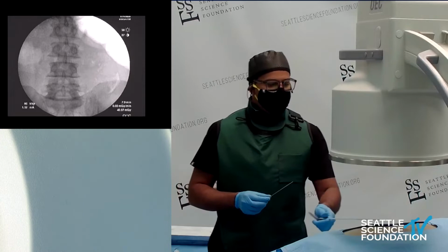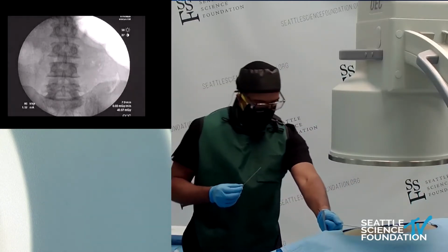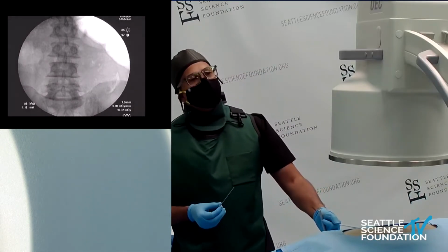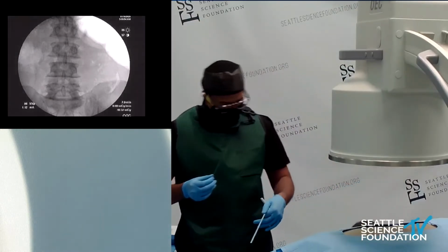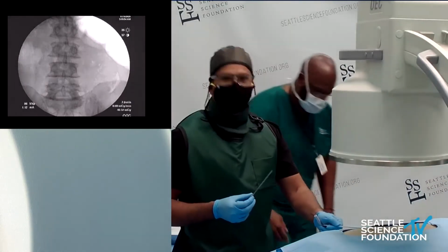So what I do procedurally here, Justin, if you don't mind taking a shot, and if it's possible, can I have a pedal? Do you have a pedal available from the C-arm? Perfect. Thank you. So I'm just going to show you some principles here, assuming we're going for that right L3.